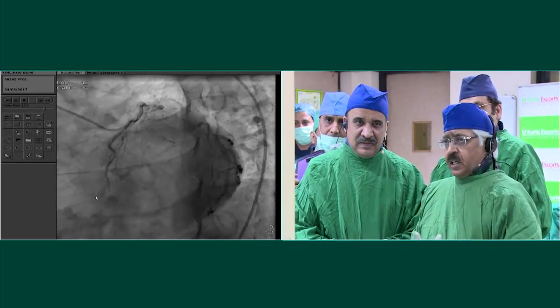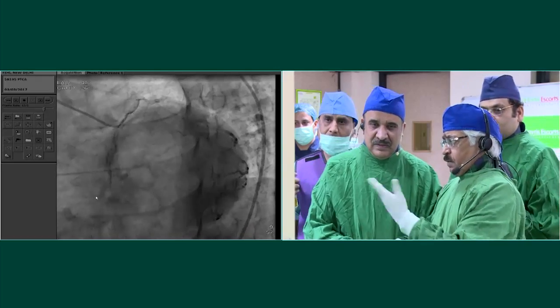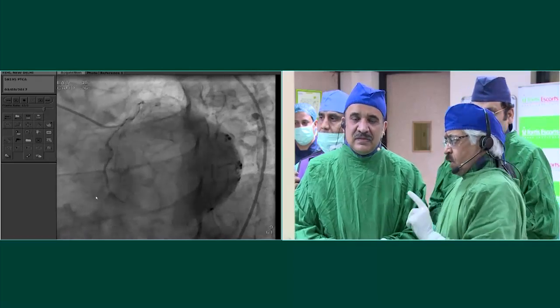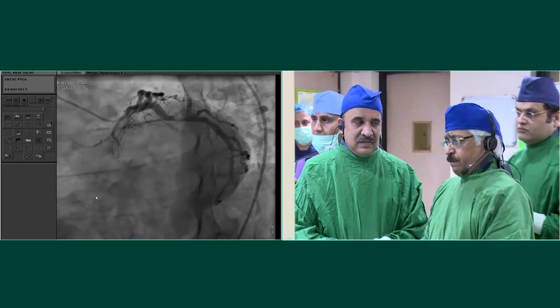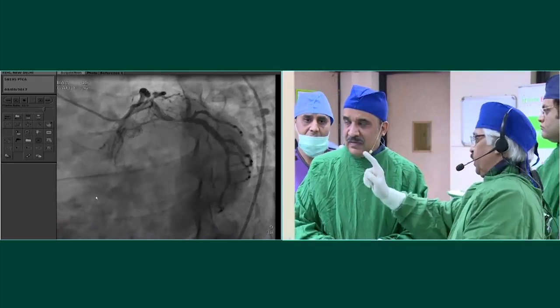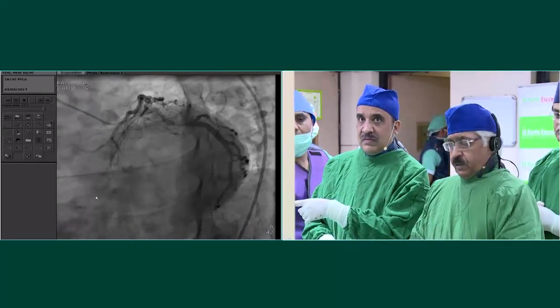But interestingly, now I did FFRs on all the three vessels. Let me tell you in the interest of time and show you the FFRs. The FFR on the LAD was clearly positive. Can we show them the FFR on the LAD? The camera, can the camera be on the FFR? It was 0.7.